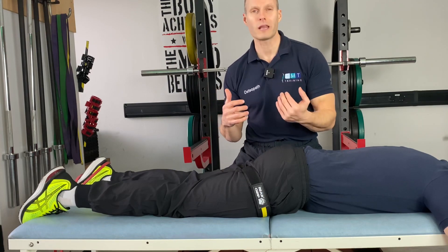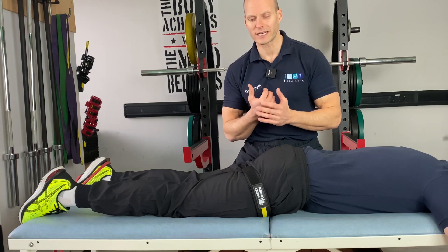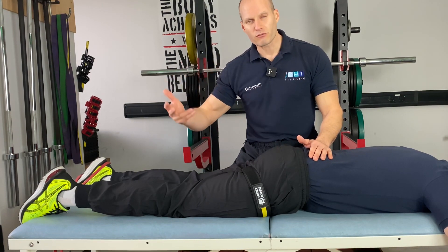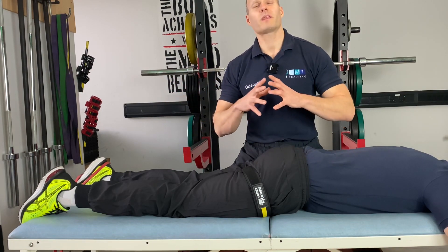Initially with rehab, especially for the hamstrings or any sort of type of rehab, it's best to start off slowly — less is more in my opinion. So what we're going to do is get the patient to very gently actively go through a hamstring movement under control.